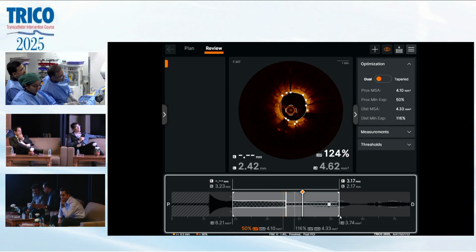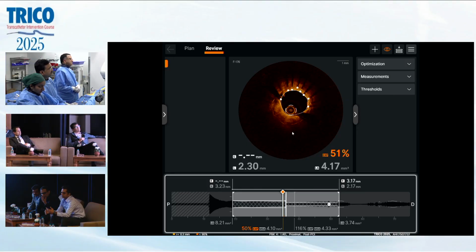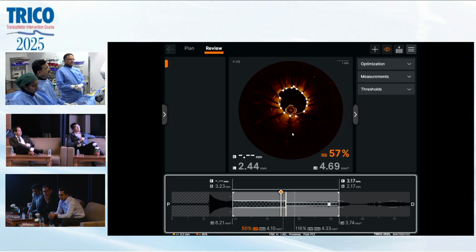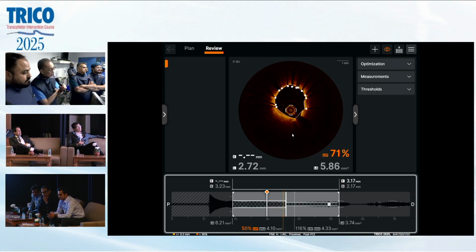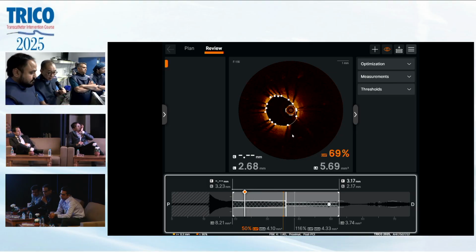The distal part is not that clean. We might need to repeat it actually. The proximal looks okay. So the area is a little bit small here, 4.1. I think we could slightly expand, post the proximal third to half of the stent with a 3.75 at a good high pressure. 14 plus, I think so. Or we can get a 3.75 by 12 and see.